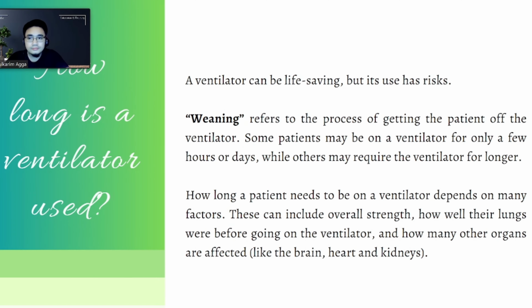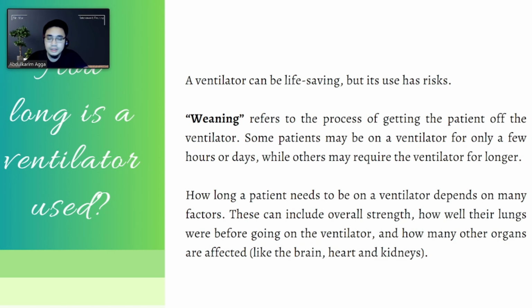Next, how long is a ventilator used? A ventilator can be life-saving, but it also has its risks, which I will discuss later on. Weaning refers to the process of getting the patient off the ventilator, and some patients may be on a ventilator for only a few hours or days, while others may require the ventilator for a longer period of time.